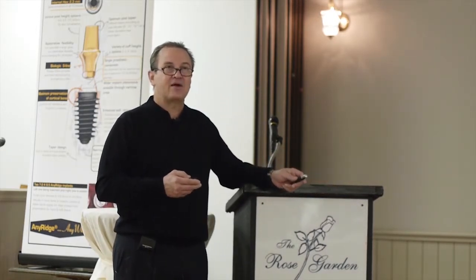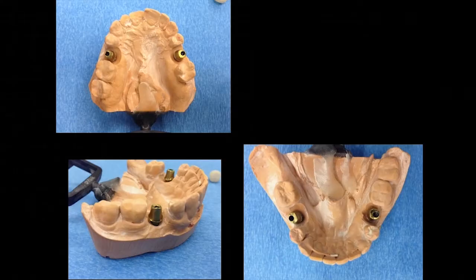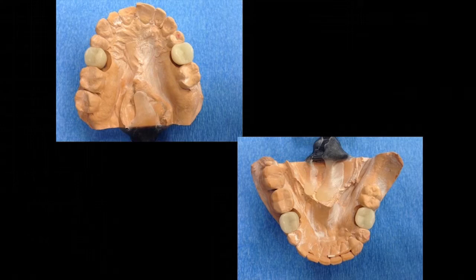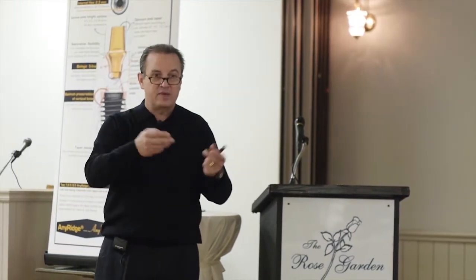Like I said, I'm not real wild about it. I think it's going to get better. It's very pricey. But this is what I like, getting this back from the lab. The soft tissue has been removed from these models, so you can't see where the gingiva is, but this margin is made to follow the free gingival margin just as it is in the mouth. When I get these back from the lab, they also come back with temporaries made on them, and real nice temporaries. So the day we deliver the case, we screw these custom abutments in, torque them in, put our temporaries on, then we refer the patient back to their dentist, or we take our final impressions that day.